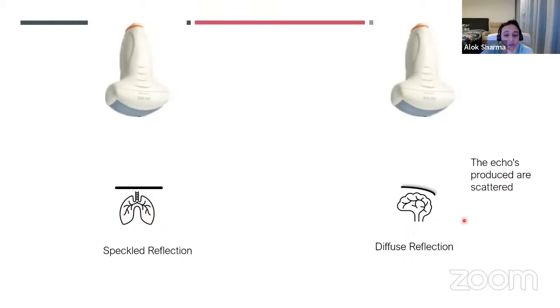But a good example is when you do cranial ultrasound. If you look at the surface of the brain, it's quite irregular, with a very bright sulcal gyral appearance. But if you go into the deeper structures of the brain, you have a lot of different echoes, which then produce what we call the individual intricacies of the anatomy.